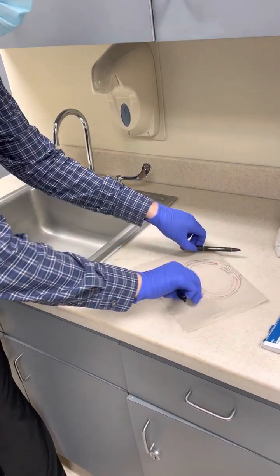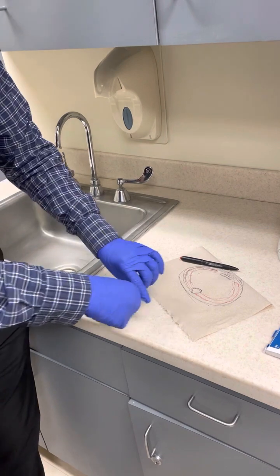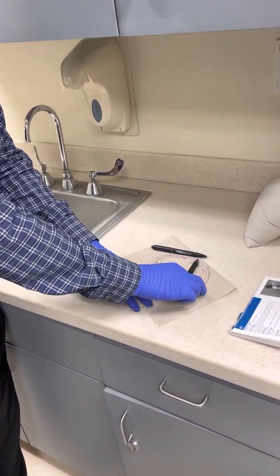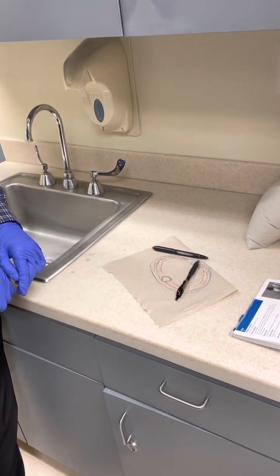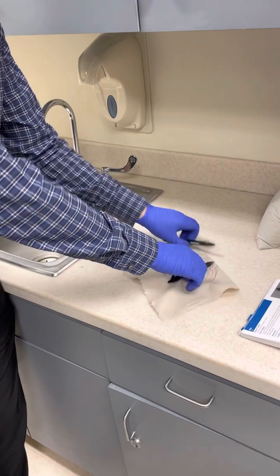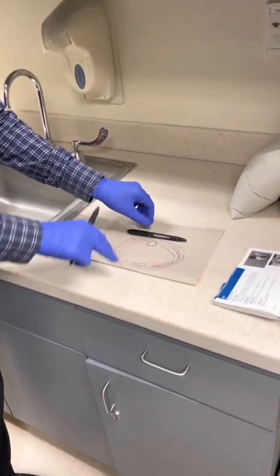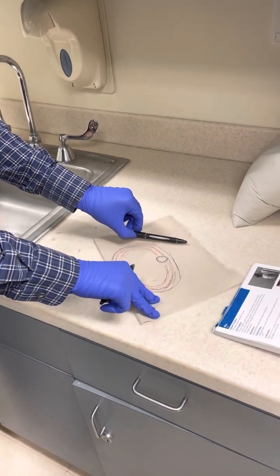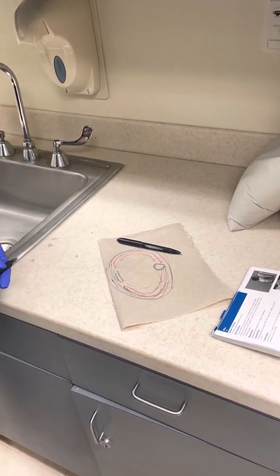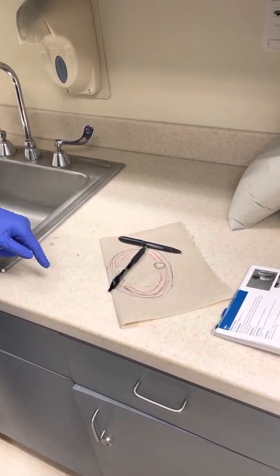You flip this around, LAO, right? Now this is an LAO, right? Now the spine's on top of these left ribs, and the right ribs are the ones without superimposition. Make sense? But what if this was posterior? What if the IR was back here? Then RPO. So RPO, right? You look at the right. So X-rays come here, no superimposition.